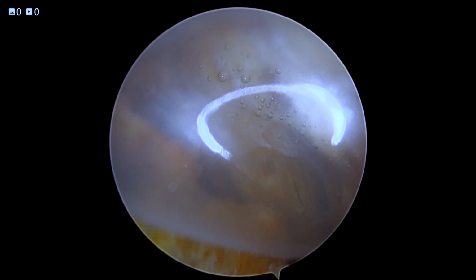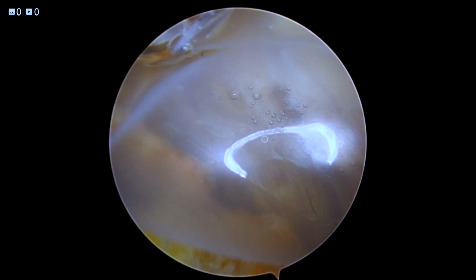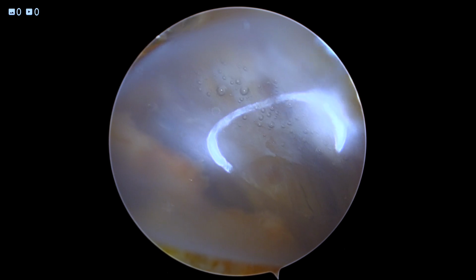At this point, the procedure is essentially complete. The next step would be to remove the camera. You would close your arthroscopic portals per standard fashion, apply a sterile dressing, and the patient is placed into a standard arm sling.